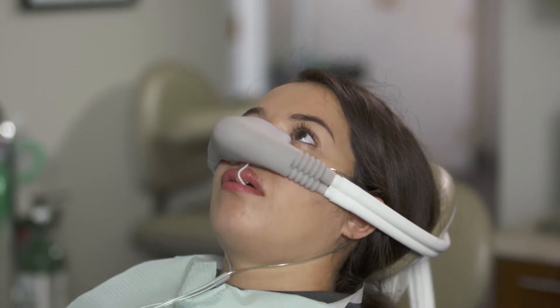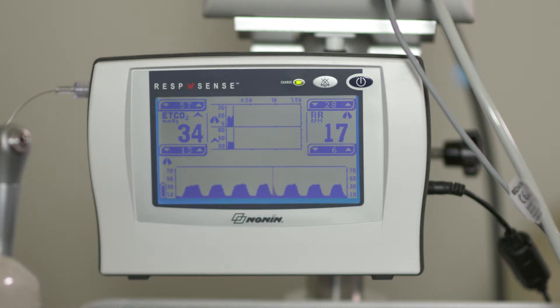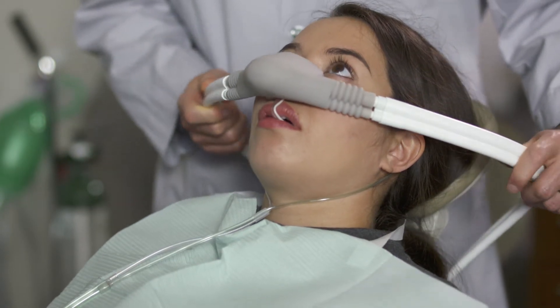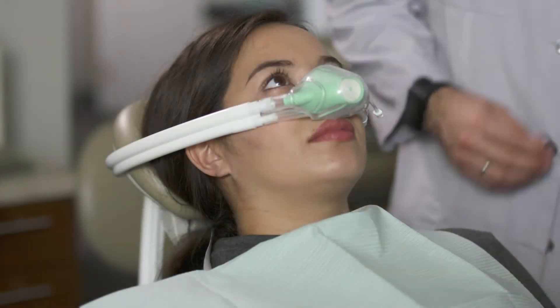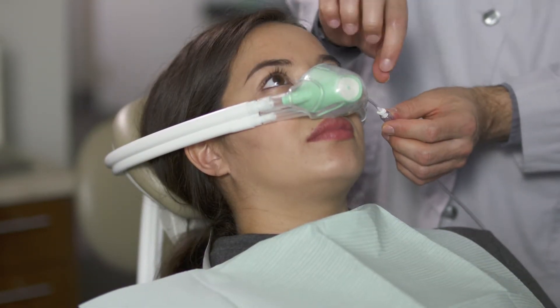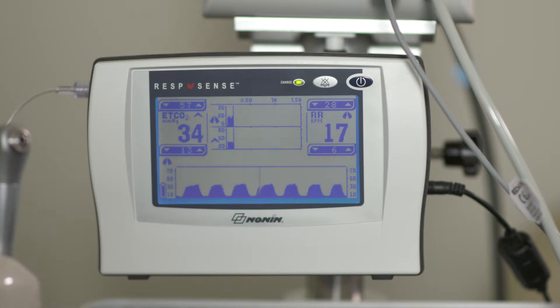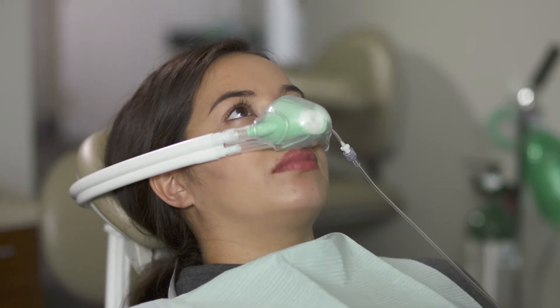A nasal hood or mask can be used with the cannula for delivery and scavenging of nitrous oxide and oxygen while simultaneously measuring end-tidal CO2. Place the nasal hood or mask over the cannula. Use a mask that fits the patient well to get a good seal and prevent leaks. A nasal hood with a built-in CO2 connection can also be used. Take a baseline reading of the patient's end-tidal CO2 and respiration rate before applying the nasal hood, as flow from the nasal hood can affect the CO2 reading due to turbulent flow inside the nasal hood.